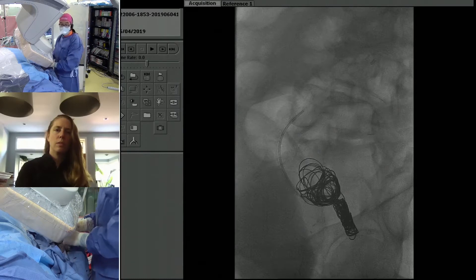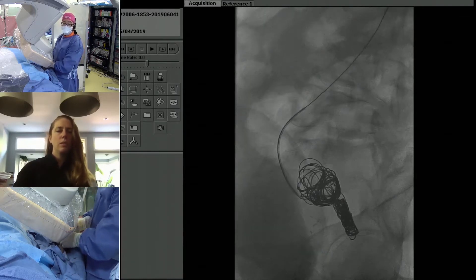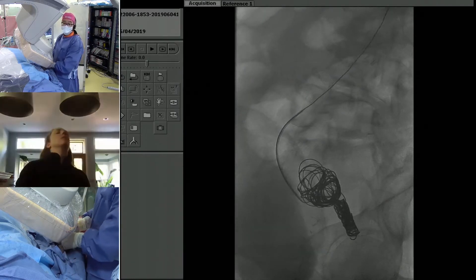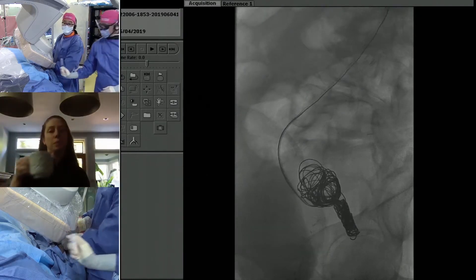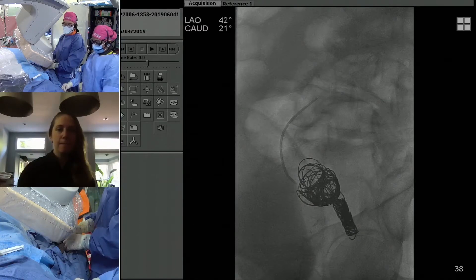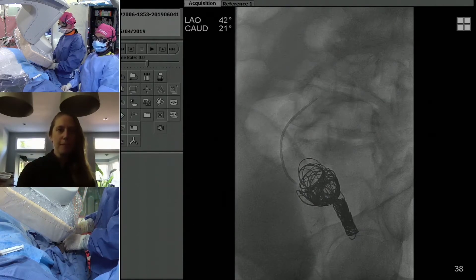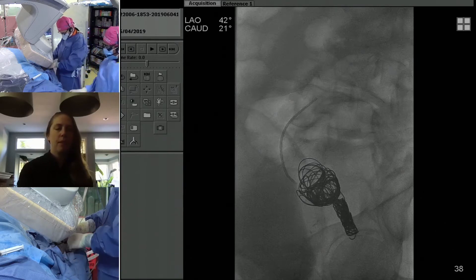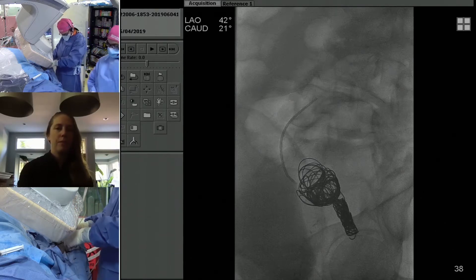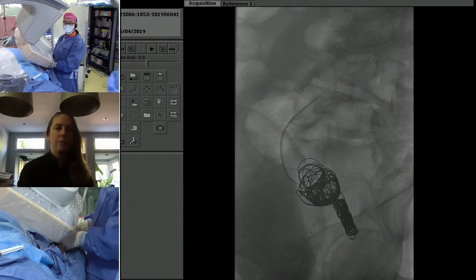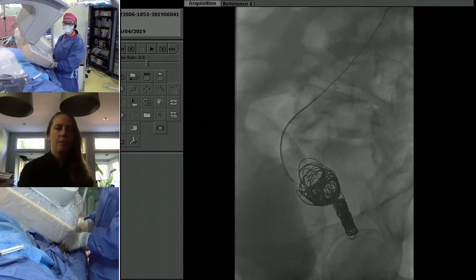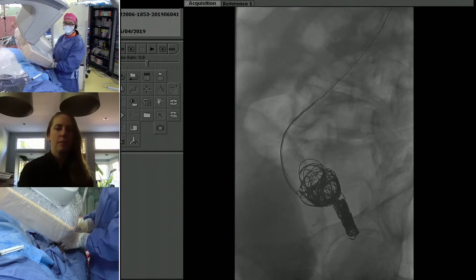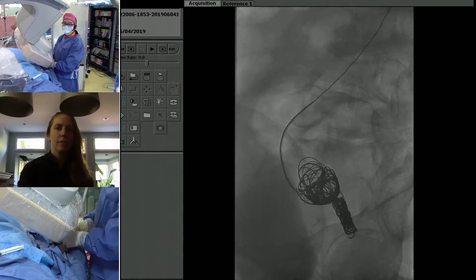I feel like we have about another 10 or 15 coils to go. Luckily we have more coils. You just don't want to be the person doing the embo tomorrow with nothing on the shelf.